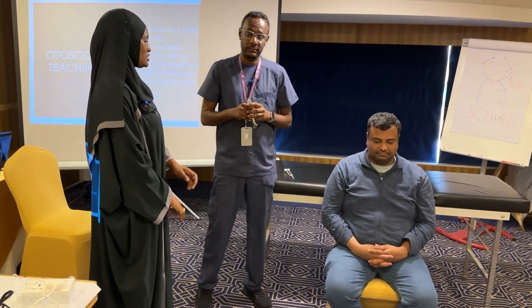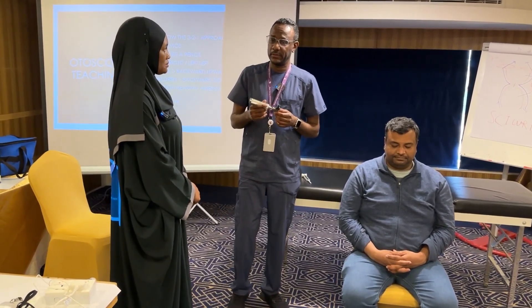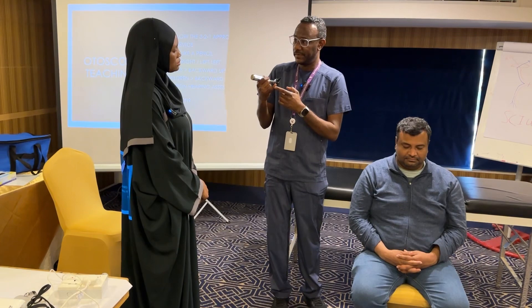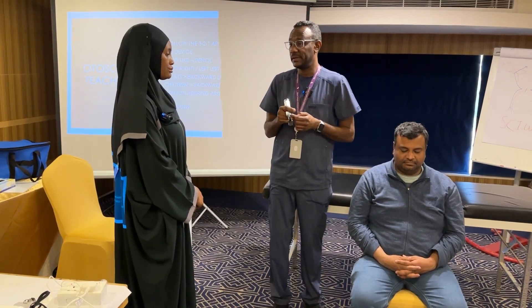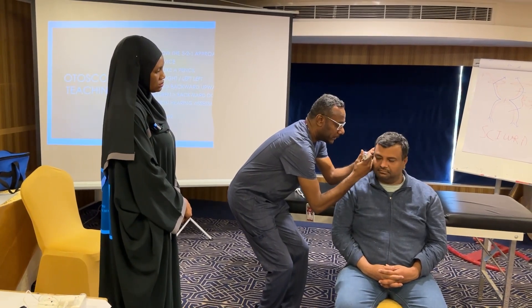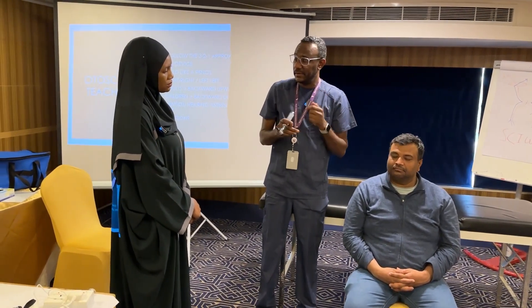So this is how to use the otoscope. Do you have any questions? Yes, I would like to know: is there a possibility of rupturing the tympanic membrane — to cause injury to the patient? So, we are moving with the patient, and that makes it safe — to not injure the patient. Is that all right? Yes.